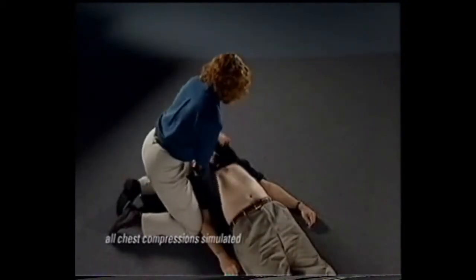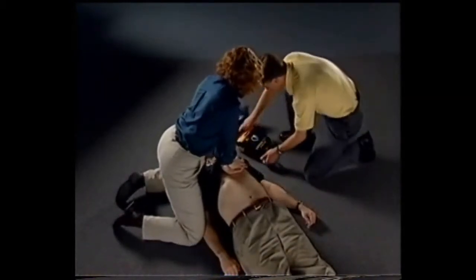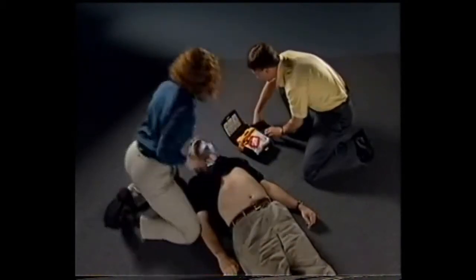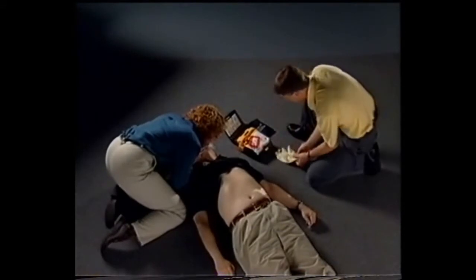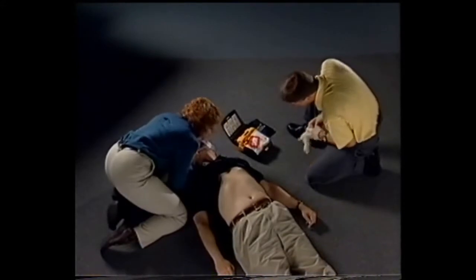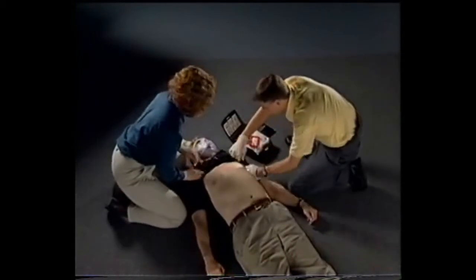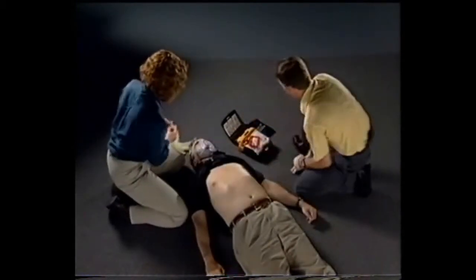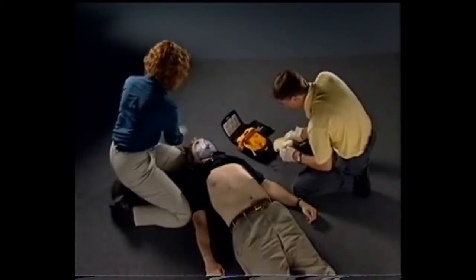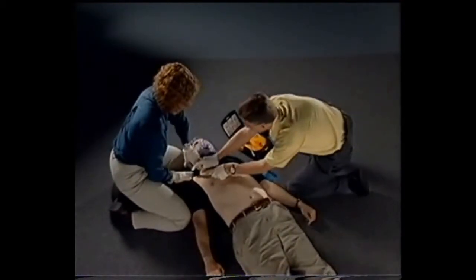Watch this simulation to see how easy it is to use the LIFEPACK CR Plus automated external defibrillator. Then we'll go back through, step by step, to learn how to use it. Call for help now. Remove clothing from chest. Voice prompts guide you through what you need to do. Pull red handle to open bag. Peel each pad off blue plastic and apply pads to exposed chest.